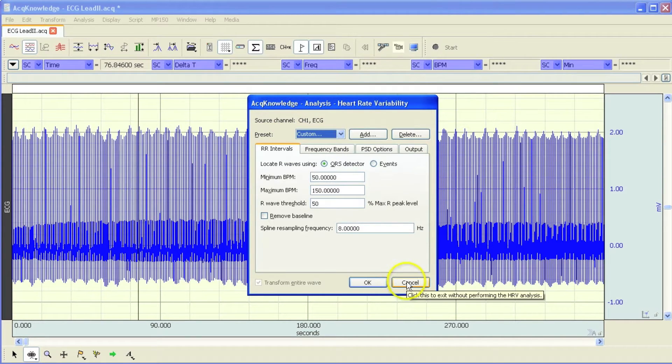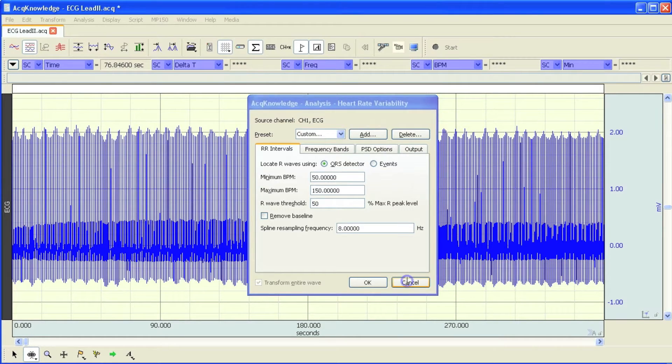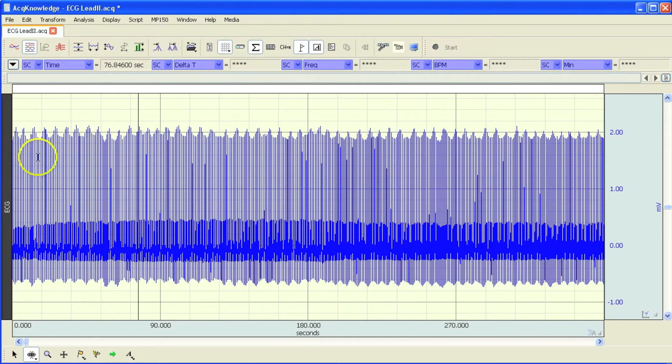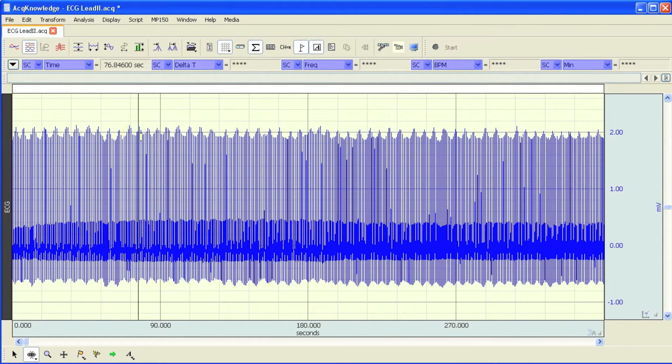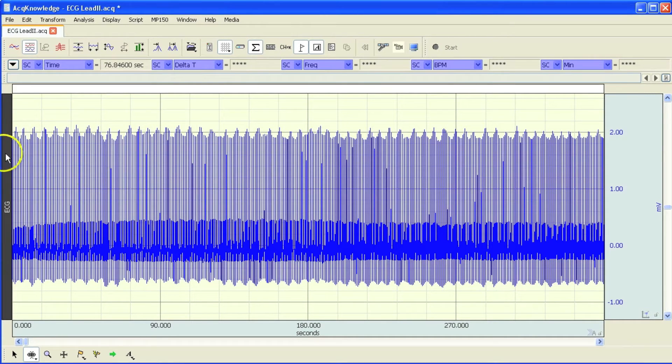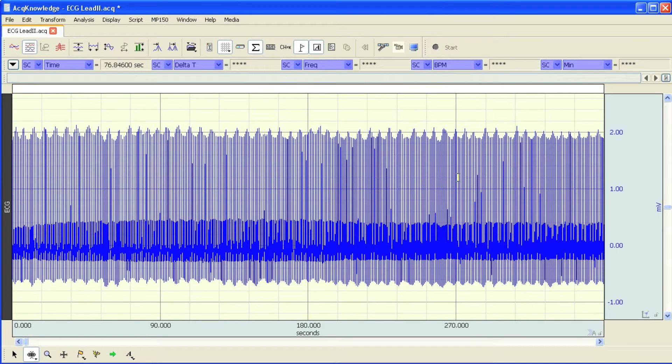It's important to remember when you are performing HRV to make sure that you have a really nice clean ECG signal. Any noise or corruption to the signal will prevent the algorithm from detecting a reliable tachogram. And that's important when performing this type of analysis.